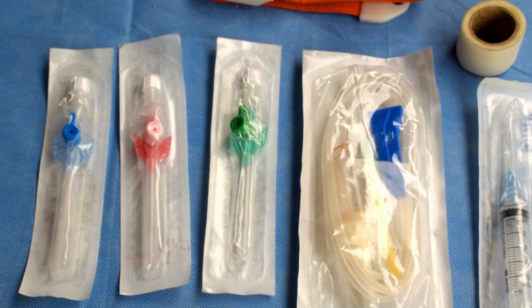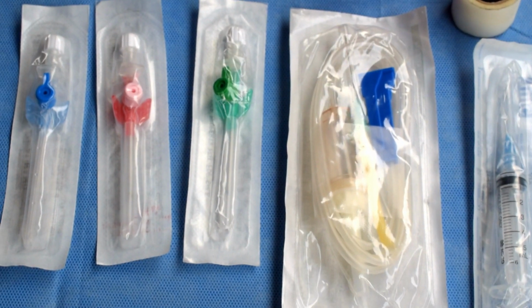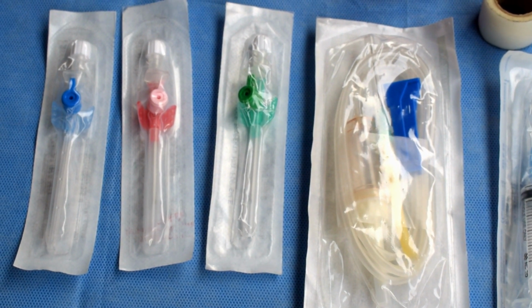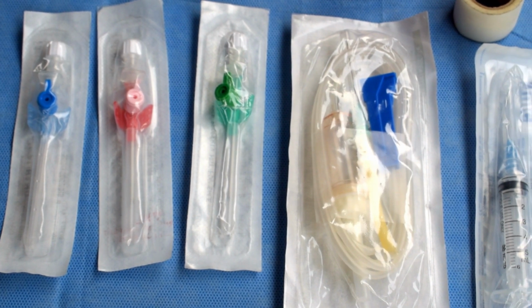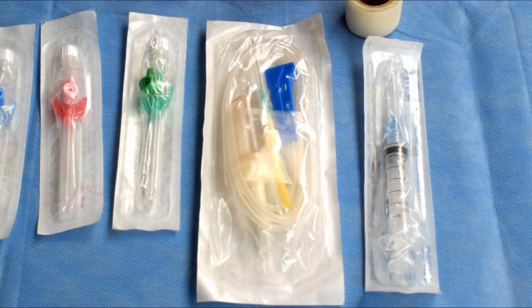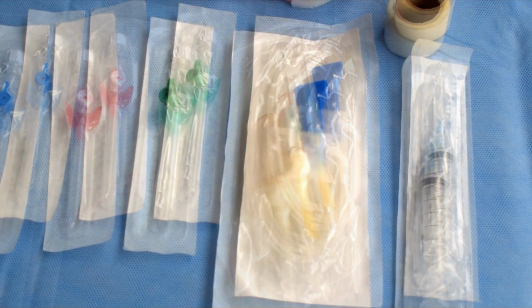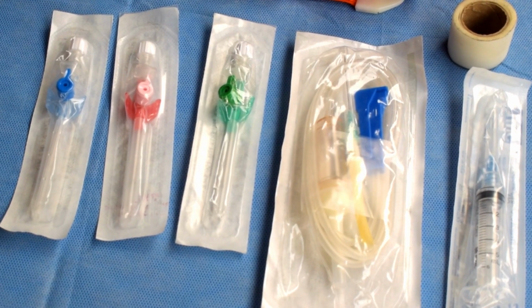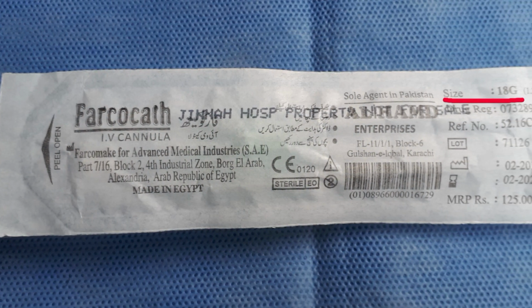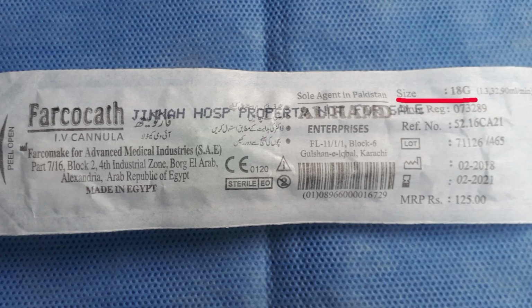Avoid going through an area of cellulitis or an extremity with an indwelling fistula. These IV cannulas are available in different colors and sizes. Only 3 of the most commonly used IV cannulas are shown. Because of the difference in the diameter of the catheter bore, we have different flow rates, and they are selected according to the need. If one is unsure about the size of the cannula, one can also look at the back of the packing. The sizes are also mentioned at the back.